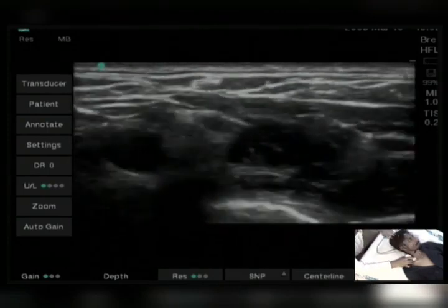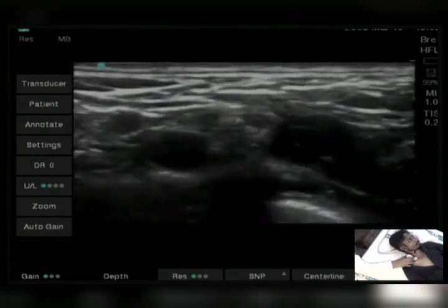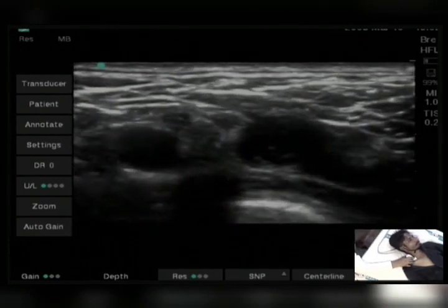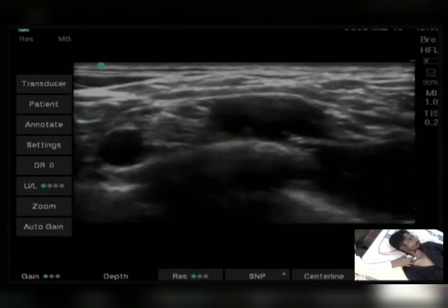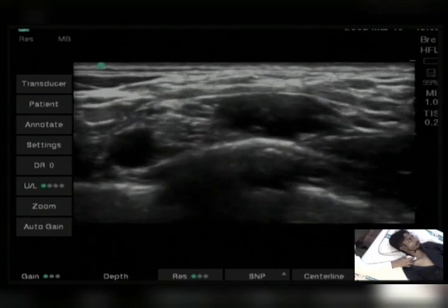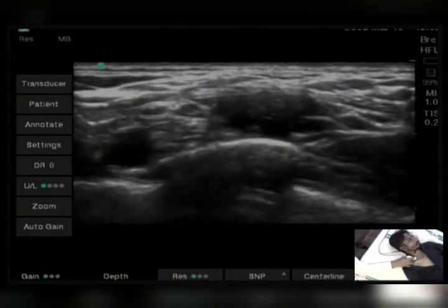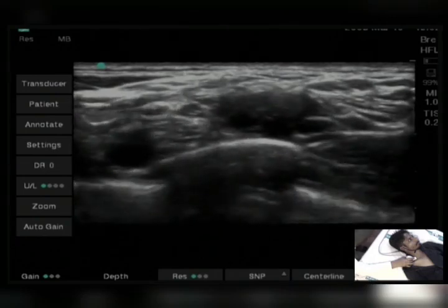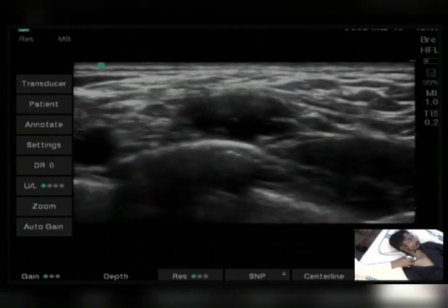Okay. When you go for supraclavicular block, you have to place the plexus on the first rib, not like this. Always make the plexus on the first rib, so as not to puncture the pleura. The rib will act as a guide and it will not allow the needle to go much deeper. Okay, and visualize the needle tip all the time.